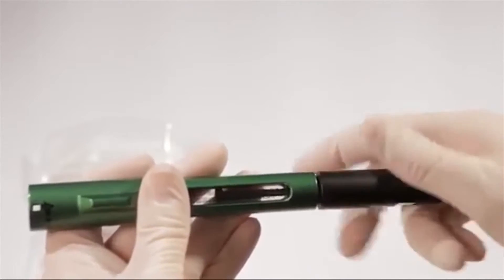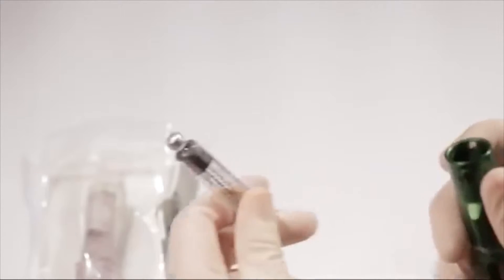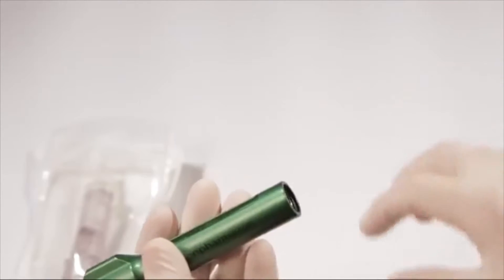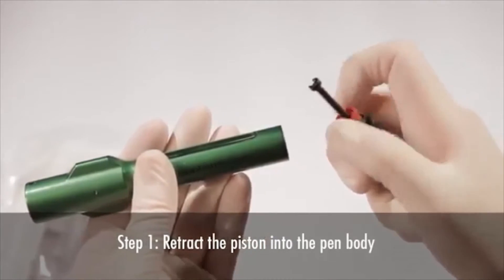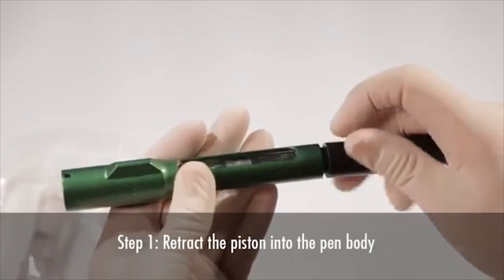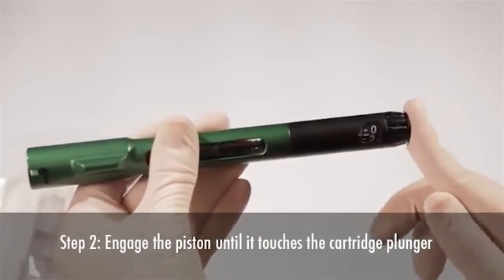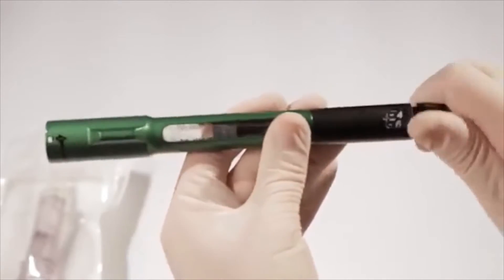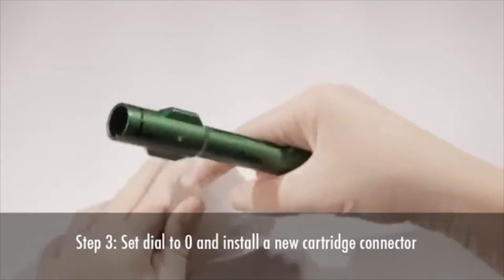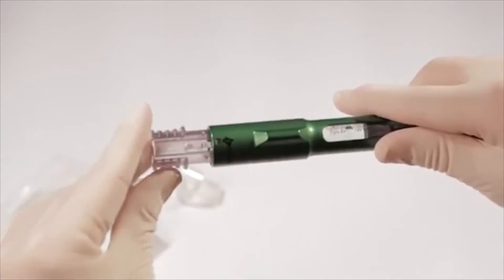To remove the used 3-milliliter cartridge, unscrew the pen and slide the used cartridge out of the pen body. Discard the used 3-milliliter cartridge. A new 3-milliliter cartridge may now be inserted. You'll need to prime the mixing pen as previously instructed when you insert a new 3-milliliter cartridge.